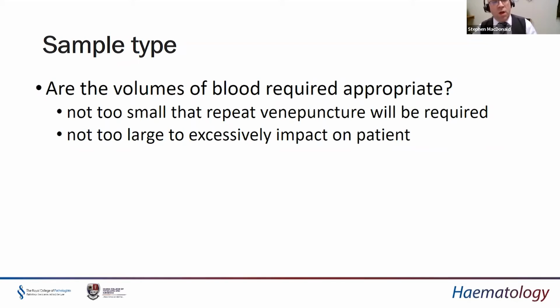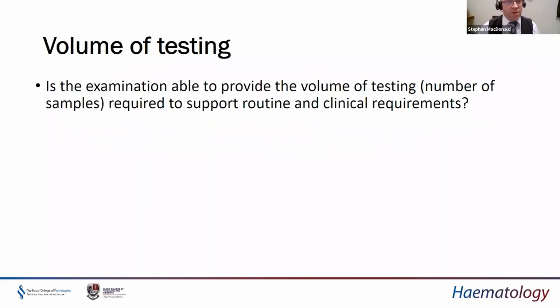But also, are we making sure that we request enough blood so that we can do all of the testing that we need to do in a clinically appropriate time frame, and we're not having to recall patients back into phlebotomy services or inconvenience patients by having them come back to repeat appointments in the hospital, wasting time, resources, and effort because we haven't taken enough sample in the first place.